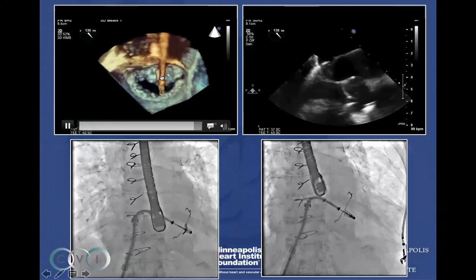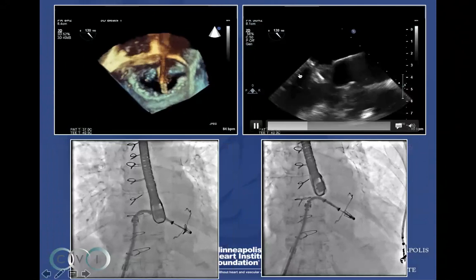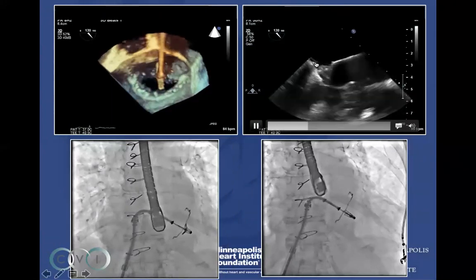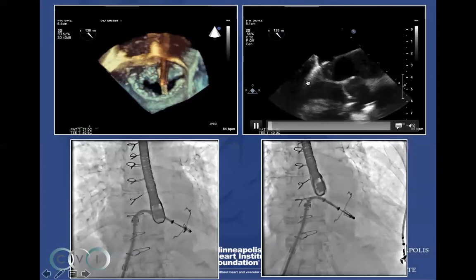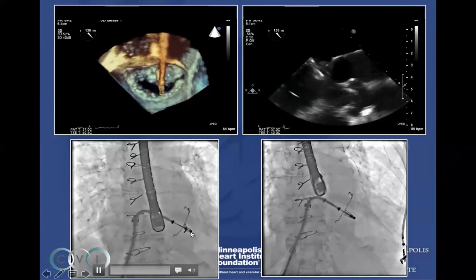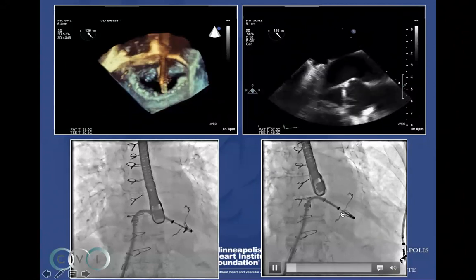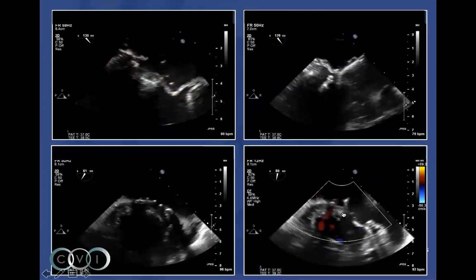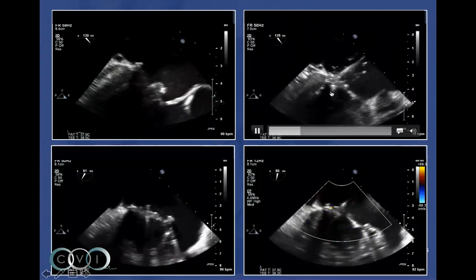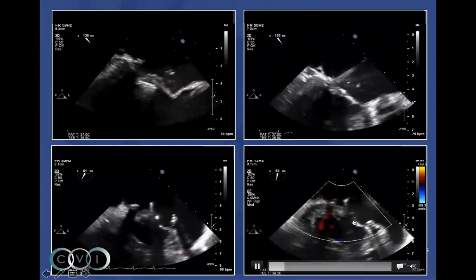You can see the MitraClip aligned over the central area of MR. I then push the MitraClip over and grab as much of the posterior annuloplasty — as much of the posterior annulus and the surgical annuloplasty — as possible. What I'm trying to do is grab any tissue in that posterior area and affix the anterior leaflet to the annuloplasty ring. The clip is passed over into the LV, then we pull up against that annuloplasty ring, securing the anterior leaflet to the annuloplasty ring as seen in the lower right-hand side. With the grasp: here's the anterior leaflet and you can see a small amount of tissue in the posterior annulus. We then secure it, and with that there's no residual MR.